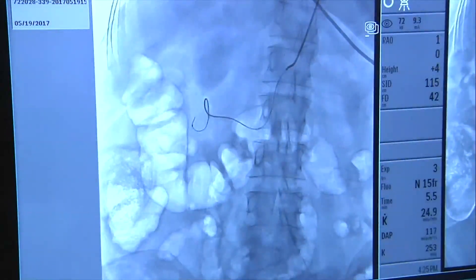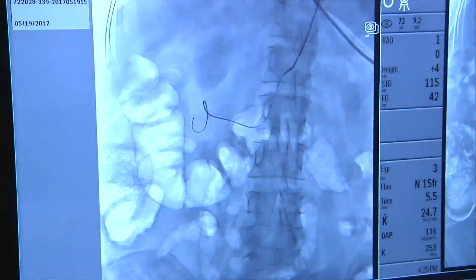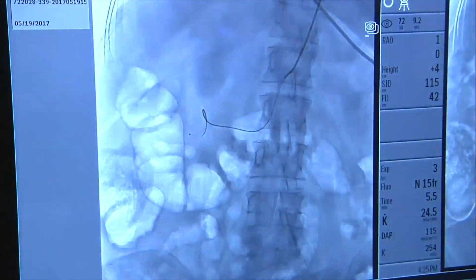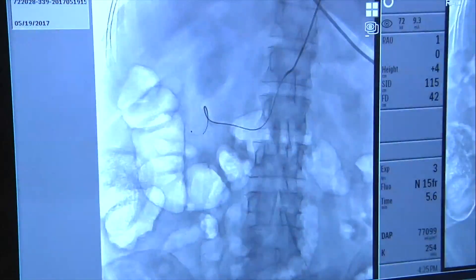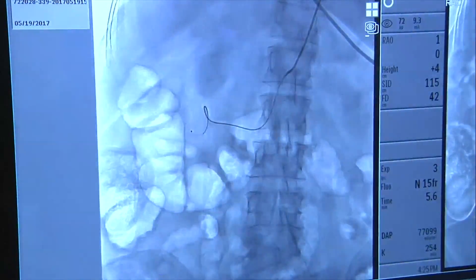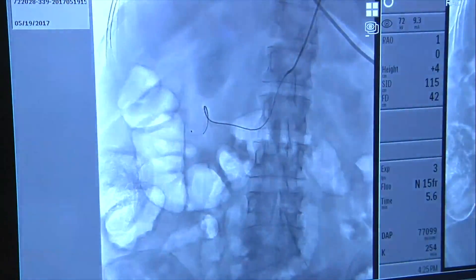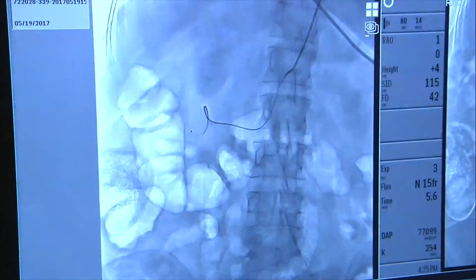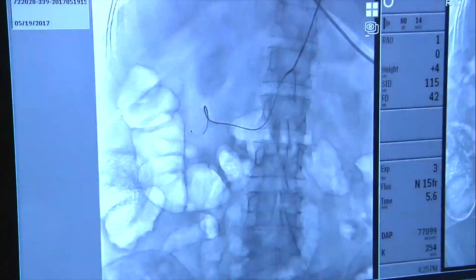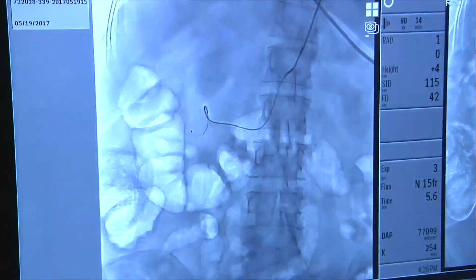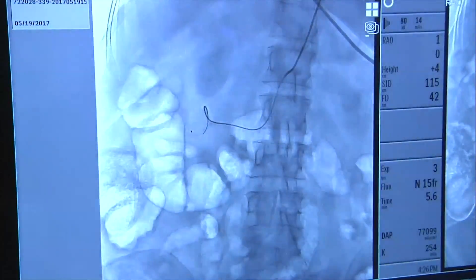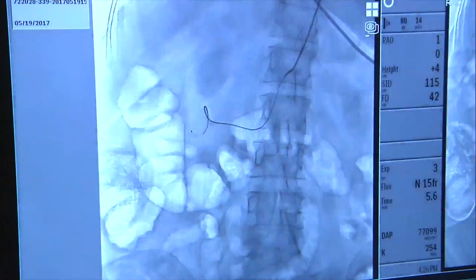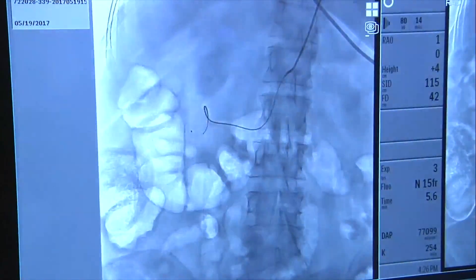That's the vessel on the cone beam CT. Dr. Kim helped us make the EmboGuide here, but it's a little bit tricky at times because especially trying to pick off colonic enhancement, you end up getting a lot of extra vessels. It actually picked off like three or four different vessels here.